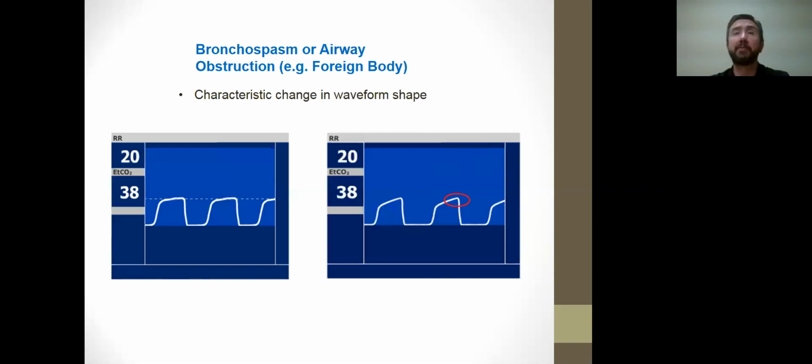And when the asthma becomes severe and the patient is tiring and has little air movement, the CO2 numbers will rise to dangerous levels above 55, 60 millimeters of mercury, okay? Definitely approaching, if not already there, respiratory failure. Even if they're conscious and they're in those numbers, they're in respiratory failure. Successful treatment will lessen or eliminate the shark fin and return that end-tidal CO2 to its normal range and normal appearance, all right? All right.